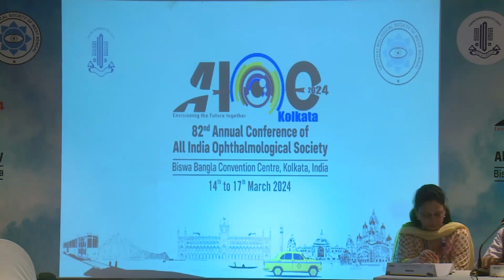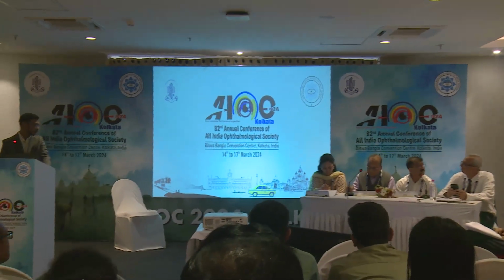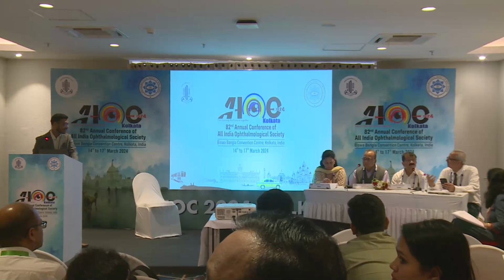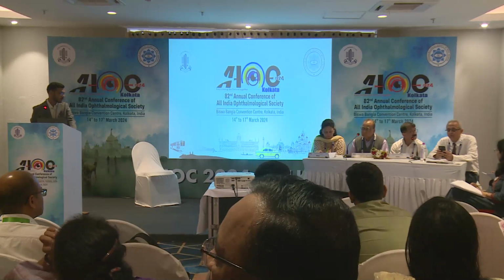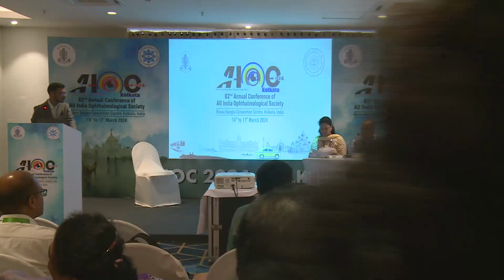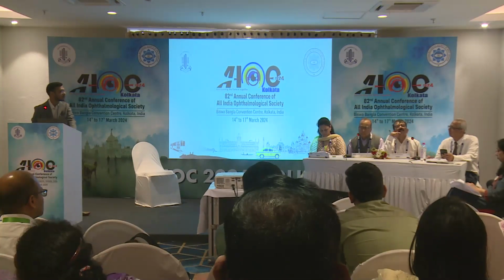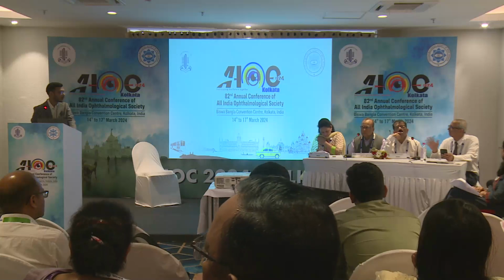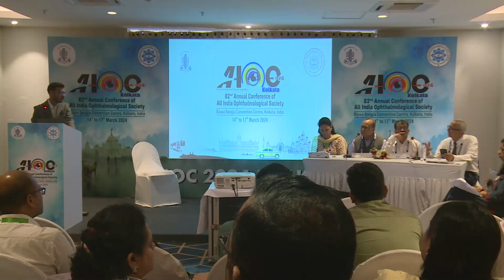I just want to ask you, you considered macular thickness as a parameter. You're comparing with ganglion cell thickness, and it's a rather dull parameter. You mentioned that GCC thickness was inferior to RNFL thickness for the detection of moderate glaucoma. I don't know whether you actually took a look at the deviation maps of ganglion cell, because that's the first thing that you will see. If you have a moderate degree of RNFL loss, the deviation map of ganglion cell loss would show you significant loss. So I don't know whether it had something to do with the machine and whether it didn't give you the deviation maps. That's something you need to go back and take a look at once again. Yes.